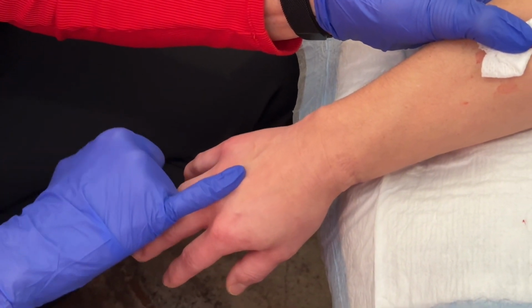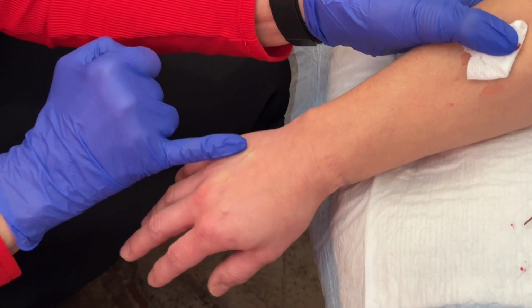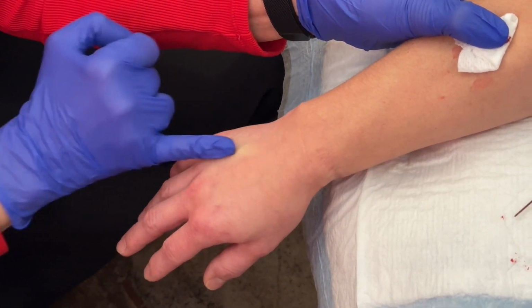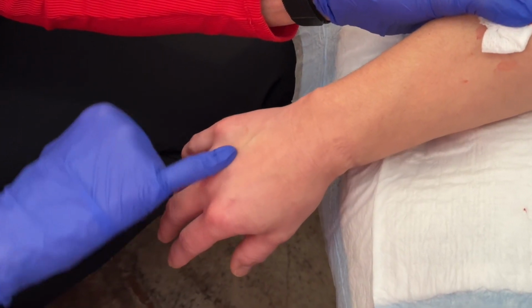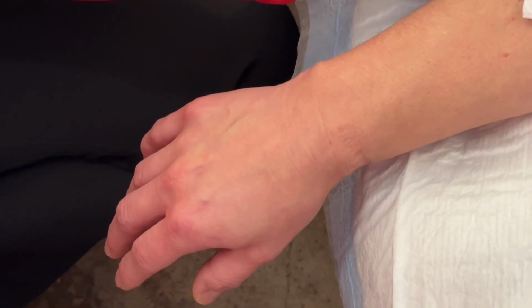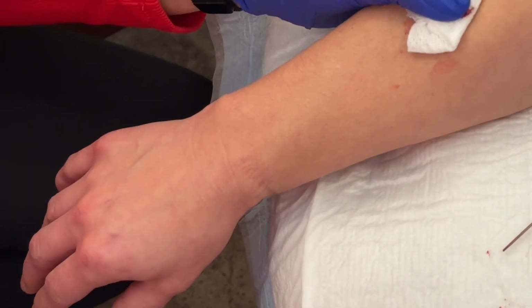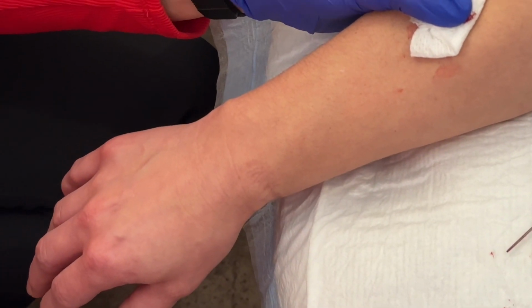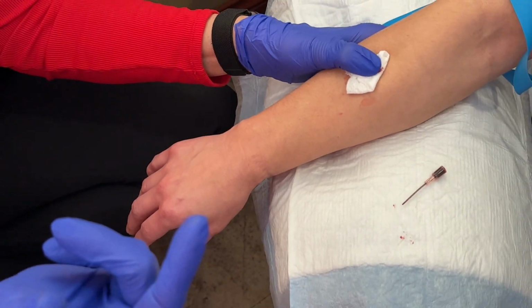Sometimes I've seen where people have poked, they're trying to go dead center of this vein. Well, there's no vein for it to go. There's nothing for this catheter to get into there. It doesn't go anywhere. So the most important thing is to pick a good vein. You want a good inch. If you're putting in a 20 gauge, you want a little over an inch of a nice straight vein. If you're putting in an 18, they're a little longer, 1.25 inches.